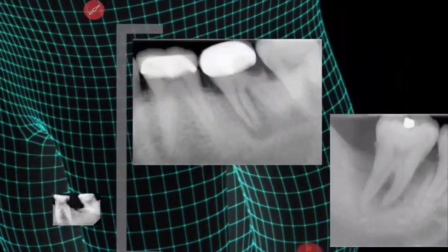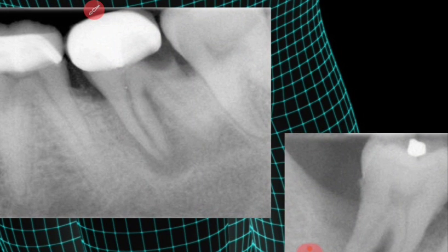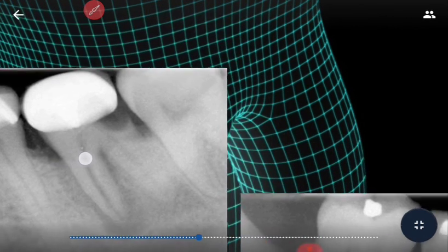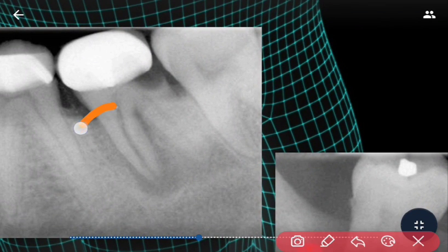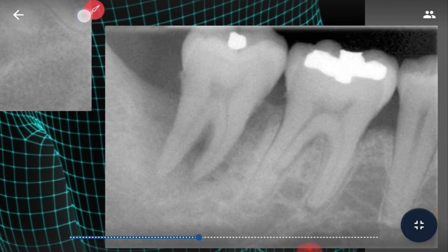Alright, let's go ahead. When you see a canal, these pictures are from our book Pathways of the Pulp, Cohen, and these are not my pictures, I've just taken them for reference. If you see a canal bigger than the other canal, like in this, the mesial canal looks so wide, the distal canal looks so narrow, this is also a sign of a crack. The whole tooth seems to be floating.